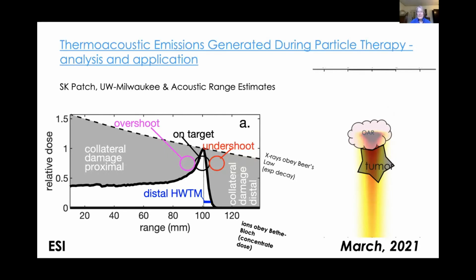And when you visit a clinic, you can see that they knock themselves out to take an X-ray radiograph and align the bony structures that they can see very well with the planning CT volume that was acquired a week or two before. So the bony structures are lined up very well, but the soft tissue can change on a daily basis.